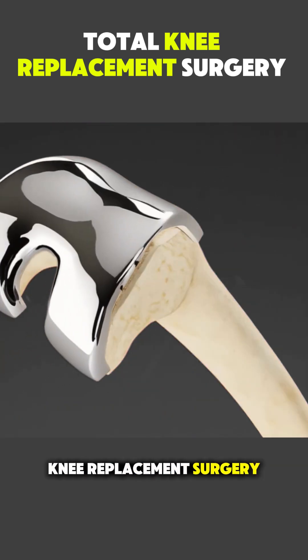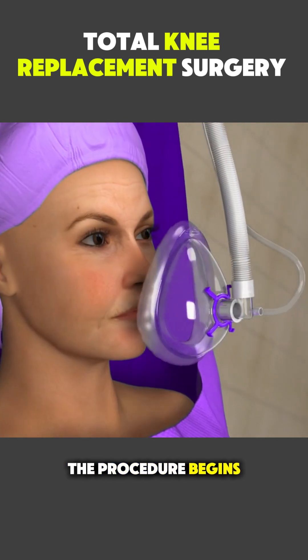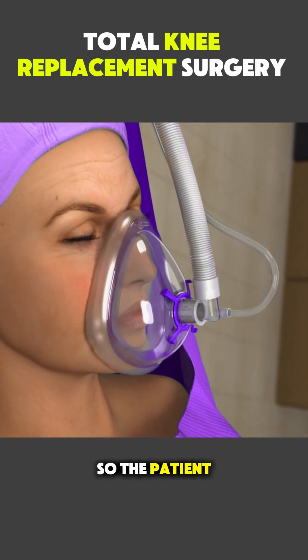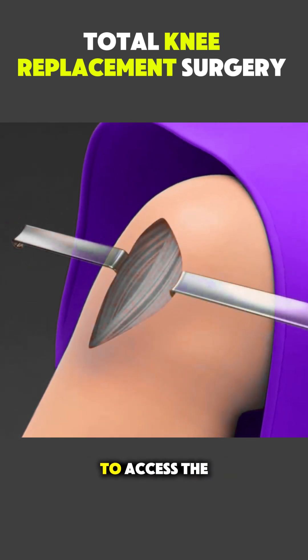Ever wondered how total knee replacement surgery is performed? Here's a simple breakdown. The procedure begins with anesthesia so the patient feels no pain. Then the surgeon makes an incision at the front of the knee to access the joint.